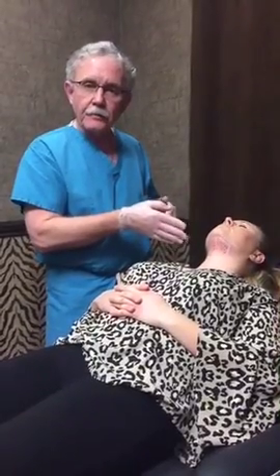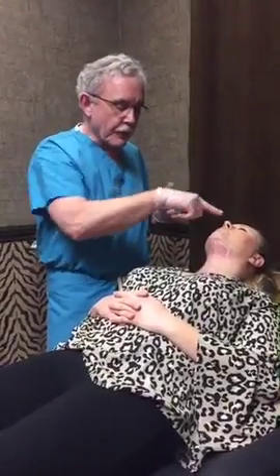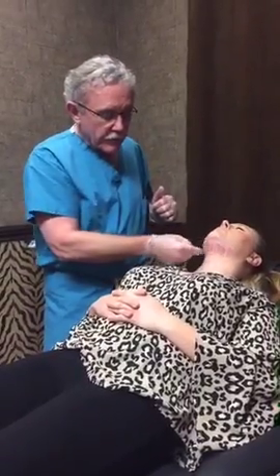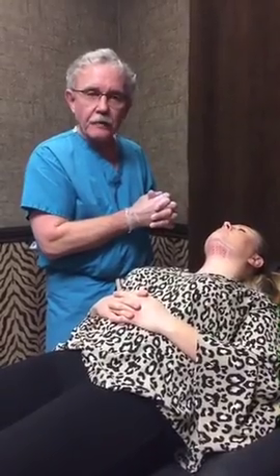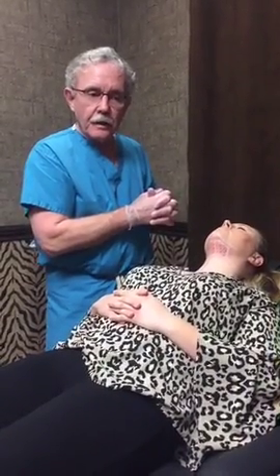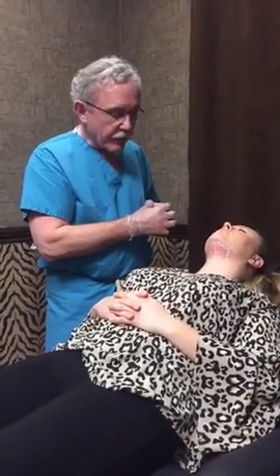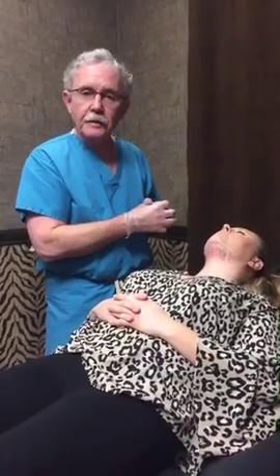But it's really nice because we're done with the treatment. There's no downtime. She can go back to work. We'll wash all this off. We'll put a little blue ice pack on here with a little strap, and she can wear that at night when she's not at work. There'll be some swelling down here. It'll actually get a little bit maybe red. It'll feel warm, tender, a little bit tight. But we really haven't had any side effects or problems with this. It's a very well controlled product.